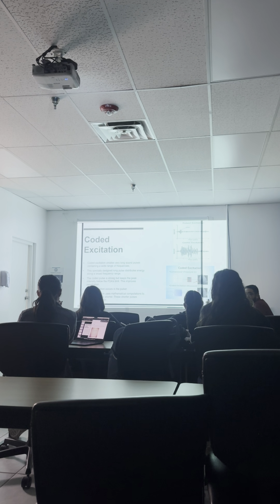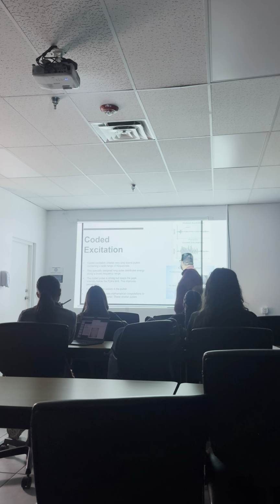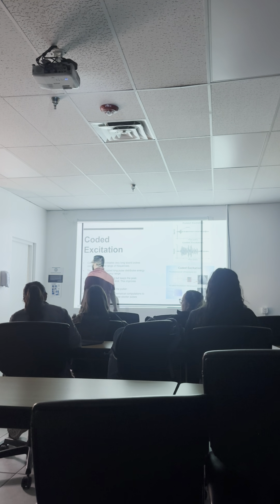Do we have to know the mathematical computations? No. To me, this doesn't make sense because it's saying that it's sending a long pulse for a long period of time, but then it says it uses it to make the pulse shorter. I guess in the bigger image, in the longer term, it might be just shorter. That's my guess.